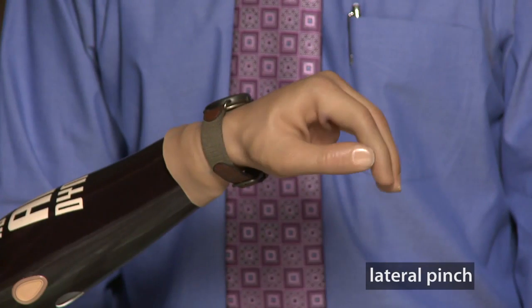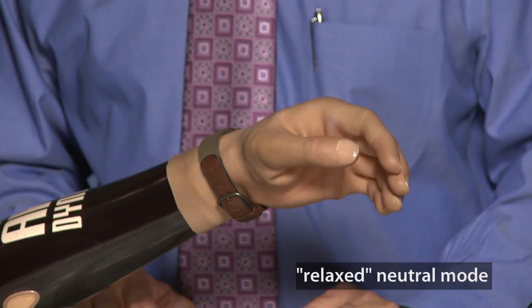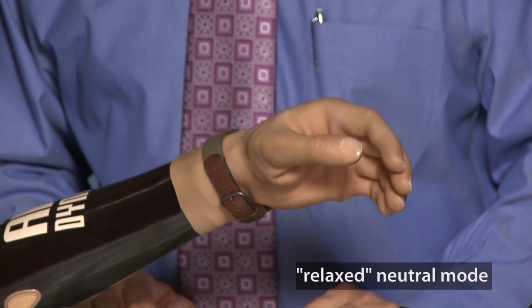What I really enjoy about the Michelangelo is that it can transition into different grasp patterns, and this provides much more functionality. This grasp pattern is a lateral pinch, which is a nice advantage. And one of the other advantages of this product is that when you relax, it goes into a neutral mode which has a very natural appearance. I really like the natural appearance of the Michelangelo hand. That's different from some of the older hands — you could be walking down the street and all of a sudden they'd be doing something unexpected. After a certain amount of time the hand will just naturally go back into this pattern.